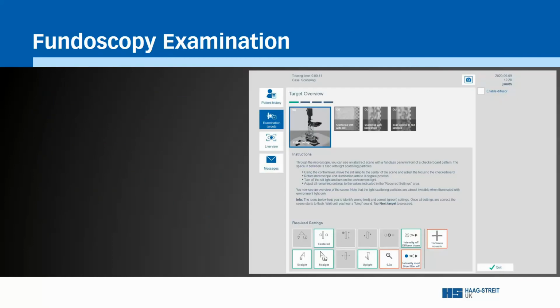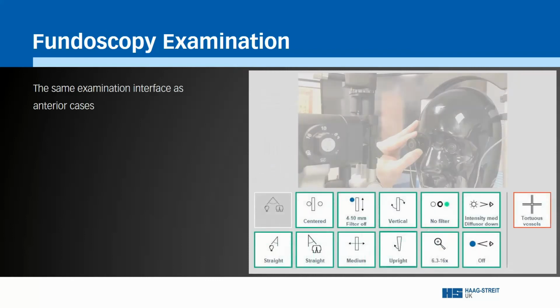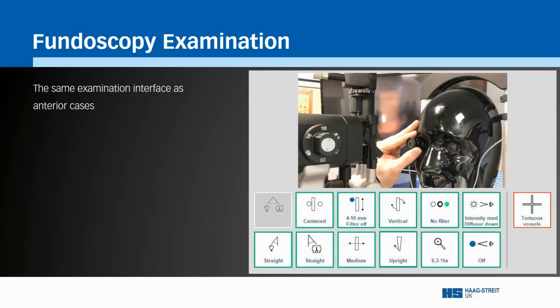The fundoscopy examination has the same interface as the anterior cases with required settings and a live view. This provides an incredibly realistic simulation of the fundoscopy exam using an auxiliary handheld lens. Again, there is an audio confirmation when the target is acquired.